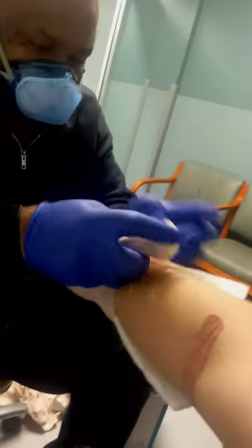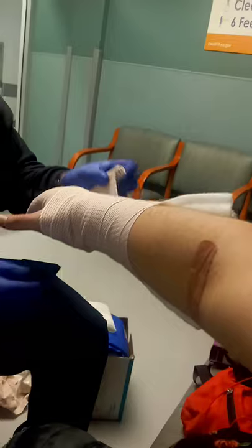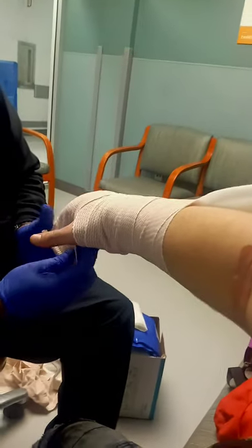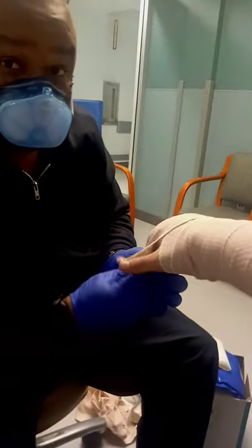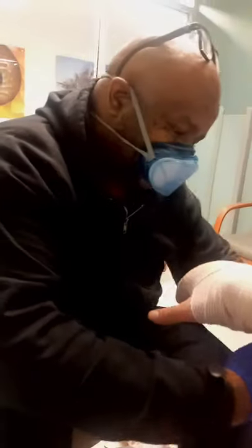I'm going to wrap this up and then make it look all nice and pretty in just a second. I'm going to fold that down so that you have this nice, pretty looking splint. Sorry if it hurts a little bit — unfortunately I do have to put a little bit of pressure on it. Not too tight? Feels good. So that it feels proper, I'm going to fold that down. See how that is?